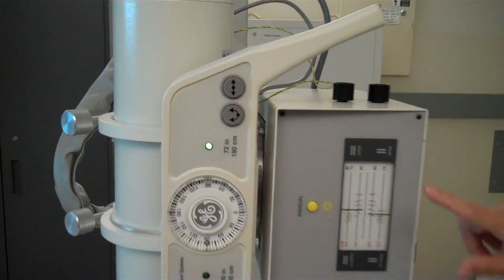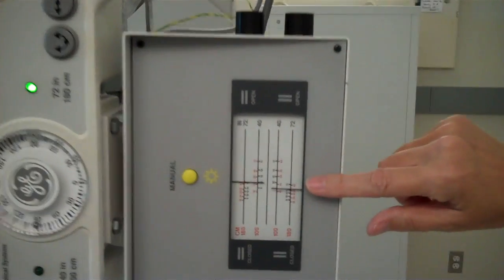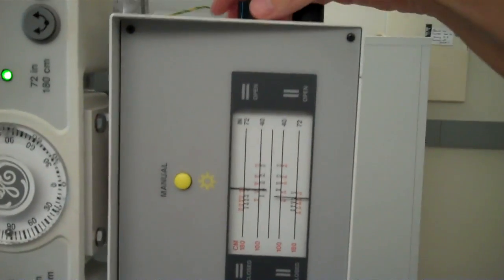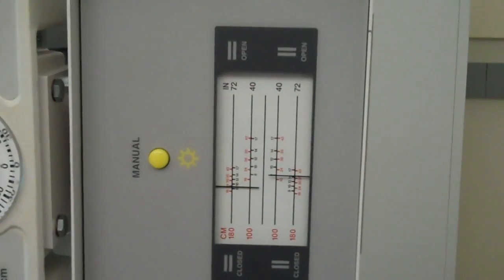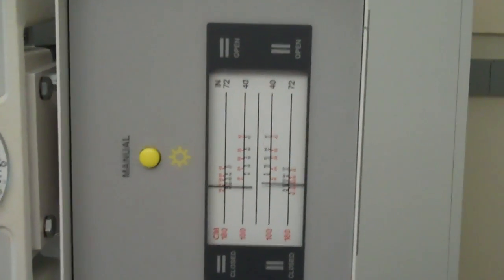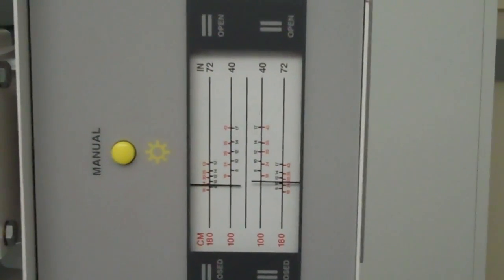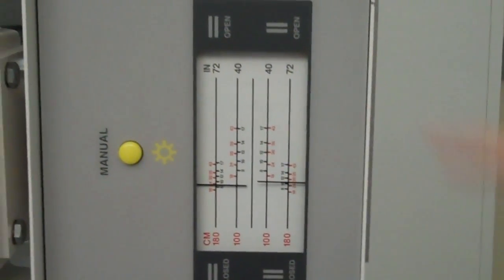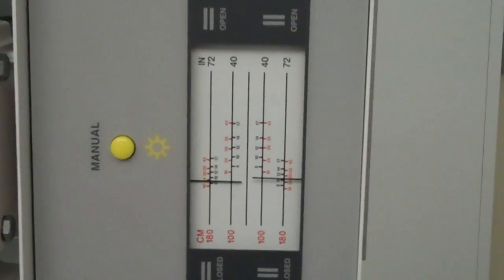Notice we will want to change our collimators now to eight by ten at the 72 inch distance.